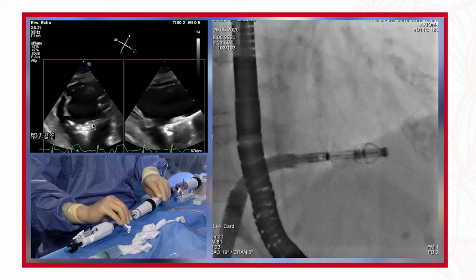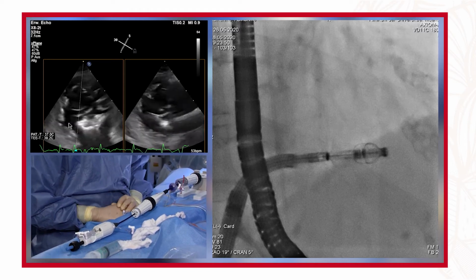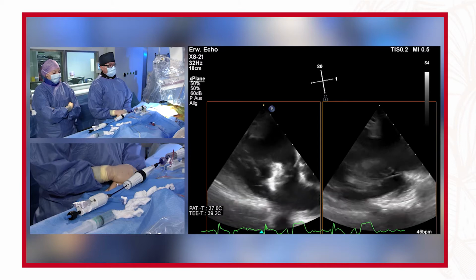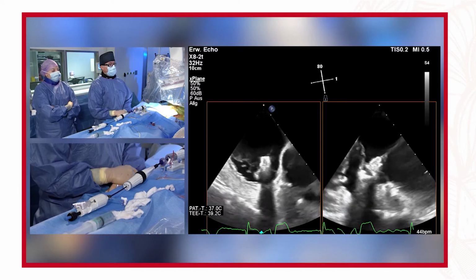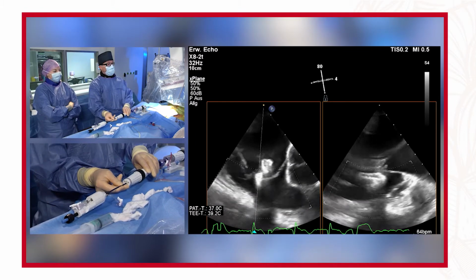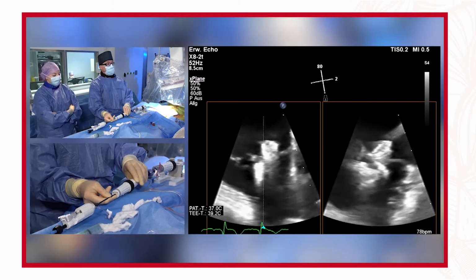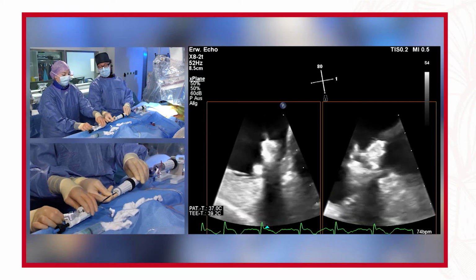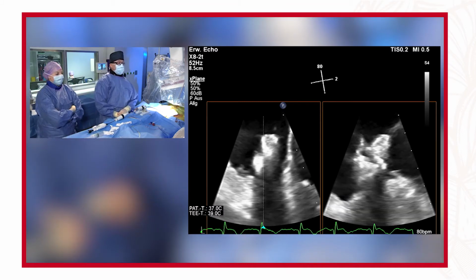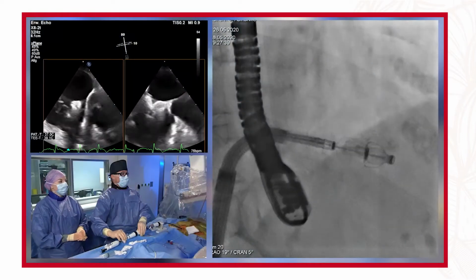Now you see that I moved over the PASCAL system to the anterior leaflet. We have a deep insertion of the anterior leaflet. And when we confirm this now in the mid-esophageal view, you see this on the right side, where the anterior leaflet is now nicely falling onto the device. I'm pulling it slightly back so that we have a good leaflet insertion, and we are sure that the leaflet is deeply inserted. The anterior clasp is coming down, as you have just seen in the last second. This video loop is being acquired so that we have the review option at a later point.